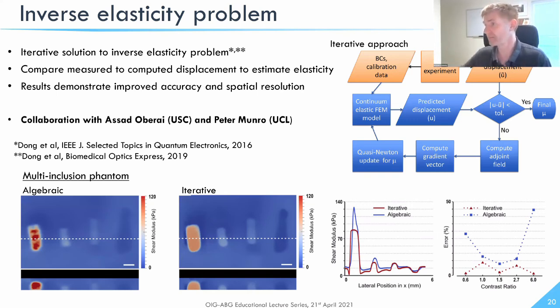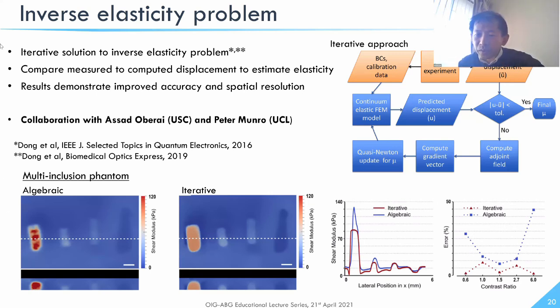But when we're on the benchtop for the mechanobiology applications, for example, we have much more time, so we can build a much more complex acquisition protocol and processing algorithms so that we can have a more complete picture. So that's certainly something we plan to do, expanding our prior work on those mechanical properties to our more current work.